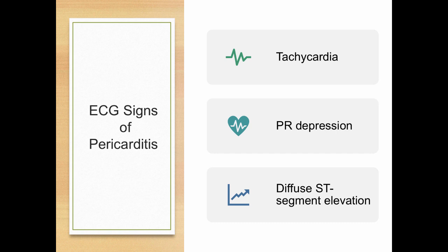We will get into ST segments and what ST segment elevation means to us when we print out that 12 lead and wonder, is this something I should be worried about? Is this a heart attack? Is this a STEMI, ST elevation MI, or is it something else? Maybe pericarditis. With pericarditis, we could see PR segment changes.